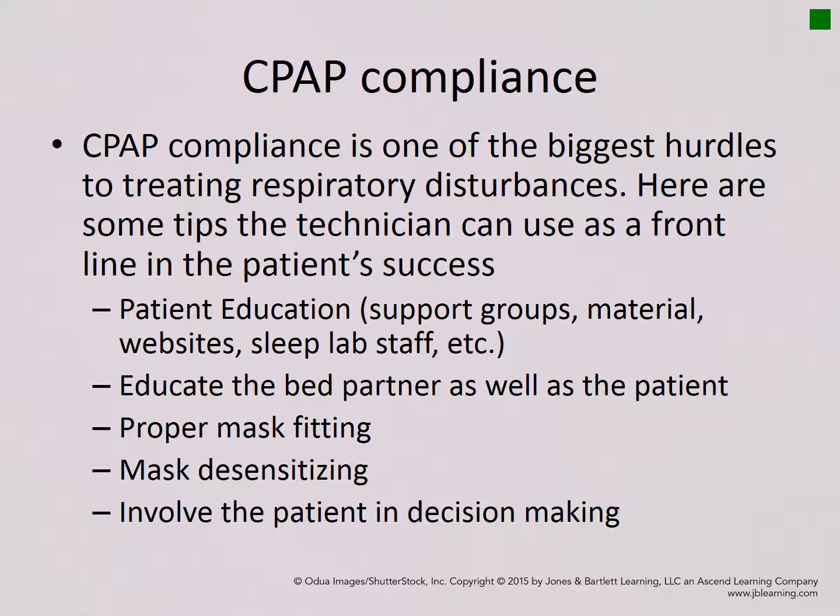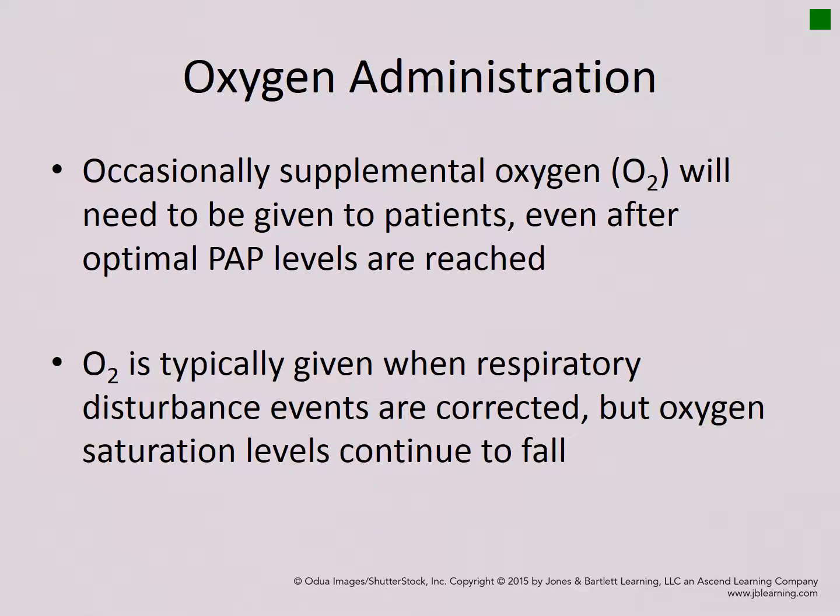Educate the bed partner as well as the patient. Make sure that you have proper mask fitting and that the patient is comfortable with their interface device. Make sure the patient has had significant time for desensitization, and involve the patient in all of the decision making about their PAP.